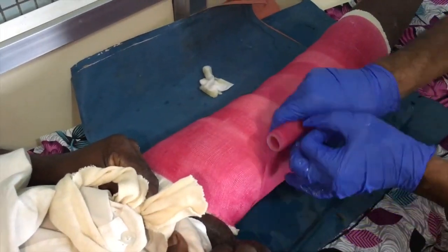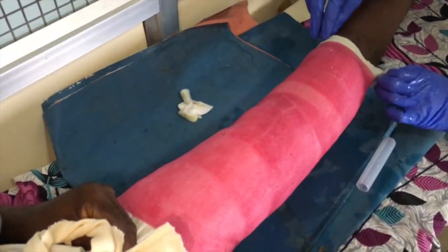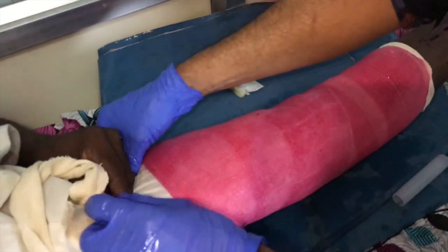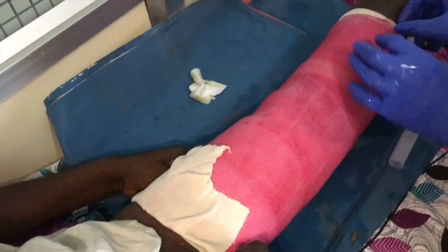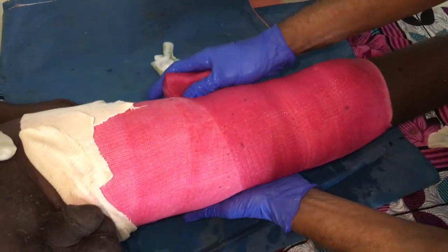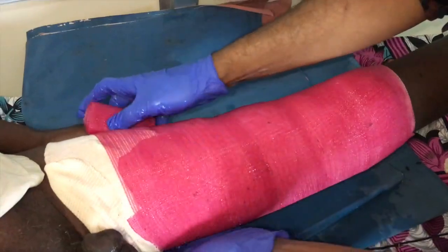A single layer of properly contoured fiberglass plaster is adequate to give reasonable stability to the bone. A second smaller plaster will reinforce this to allow the patient to be erect, mobilized, and to weight bear. The edges of the stockinette are rolled upwards to avoid cutting or digging of the sharp edges of the plaster over the skin, and the second layer is now applied from below to above.